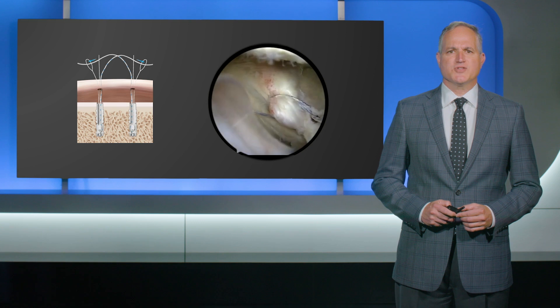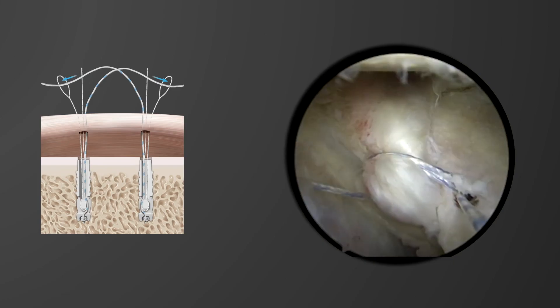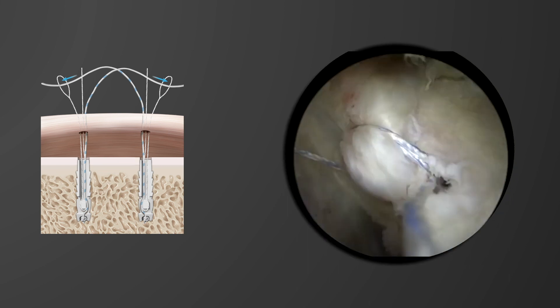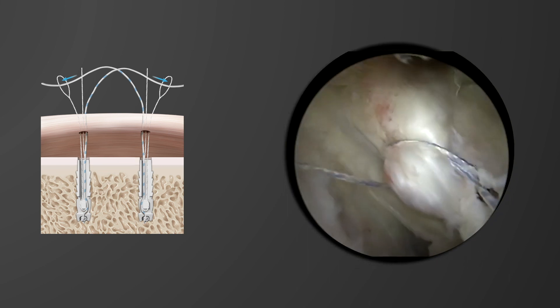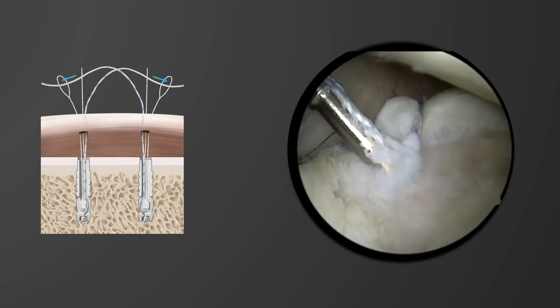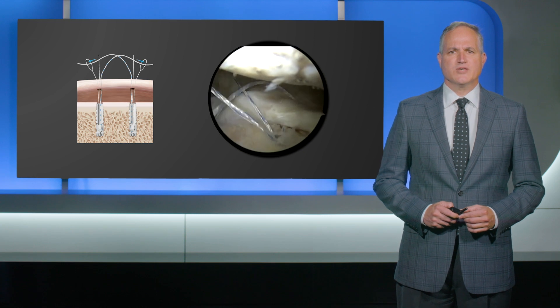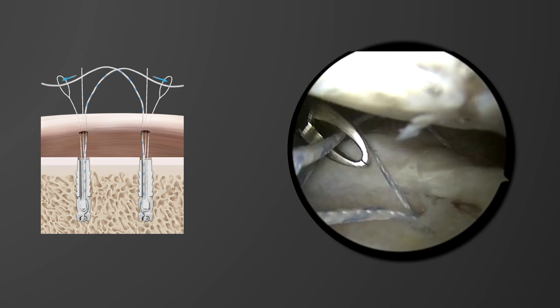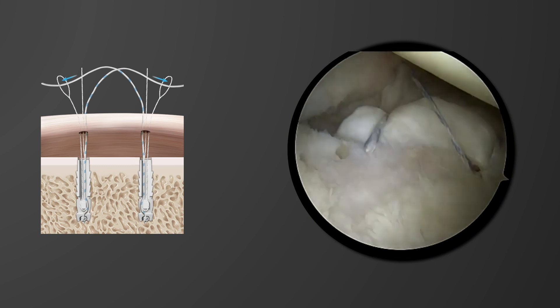Viewing from the front, the repair stitch through the medial portal can be noted exiting the subscap. The repair stitch from the lateral portal can be noted exiting the anterior cannula, and these can then be tensioned to secure and reduce the bony fragment. The percutaneous cutter can then be used to cut the suture, and in this case an extra implant was inserted inferiorly to provide three points of fixation and stabilize the bony fragment further.